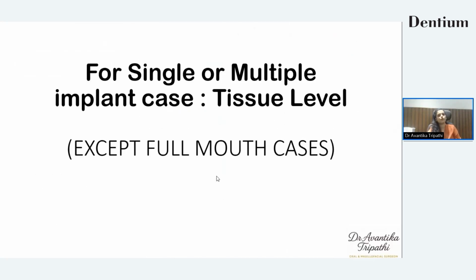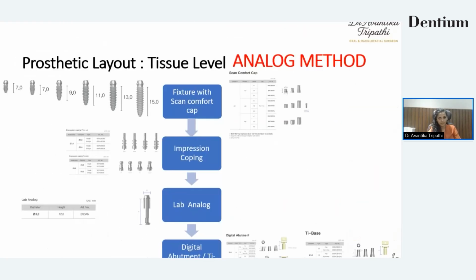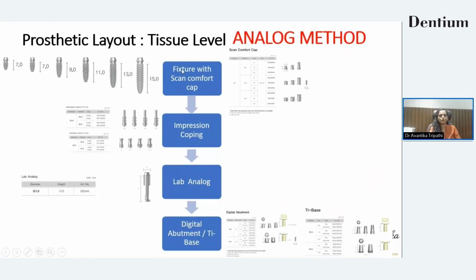If I'm going to go ahead with a single or multiple implant case tissue level, except the full mouth cases, then I'm going to place a fixture with the scan comfort cap, impression copings, lab analog, and final crown can be made using the digital abutment or TI base.